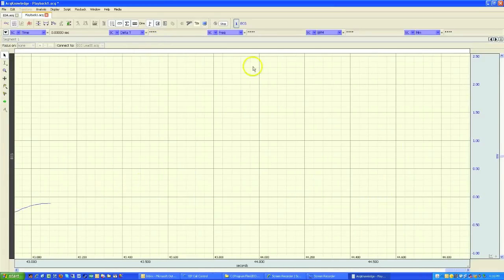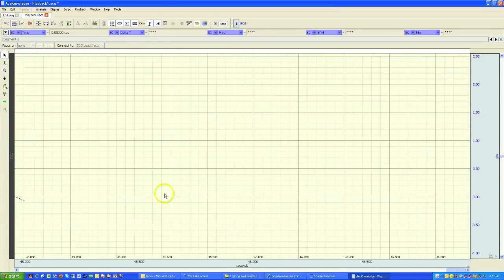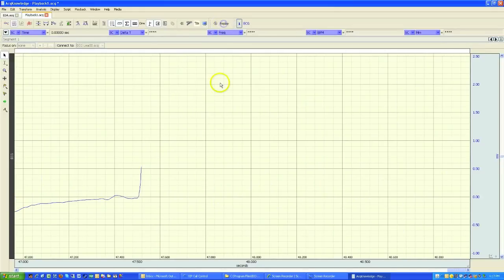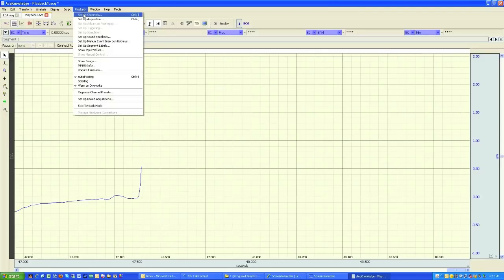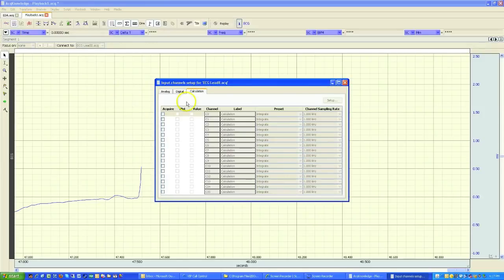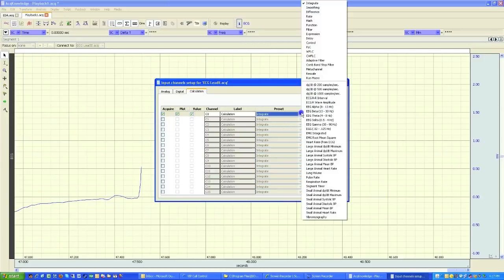So we have complete control over everything, just as if this was being recorded for the first time. The other thing we can do, which can be very useful, is adding calculation channels. So if I go to the Playback menu and select Setup Channels, we can turn on a calculation channel. And I'm going to add heart rate.